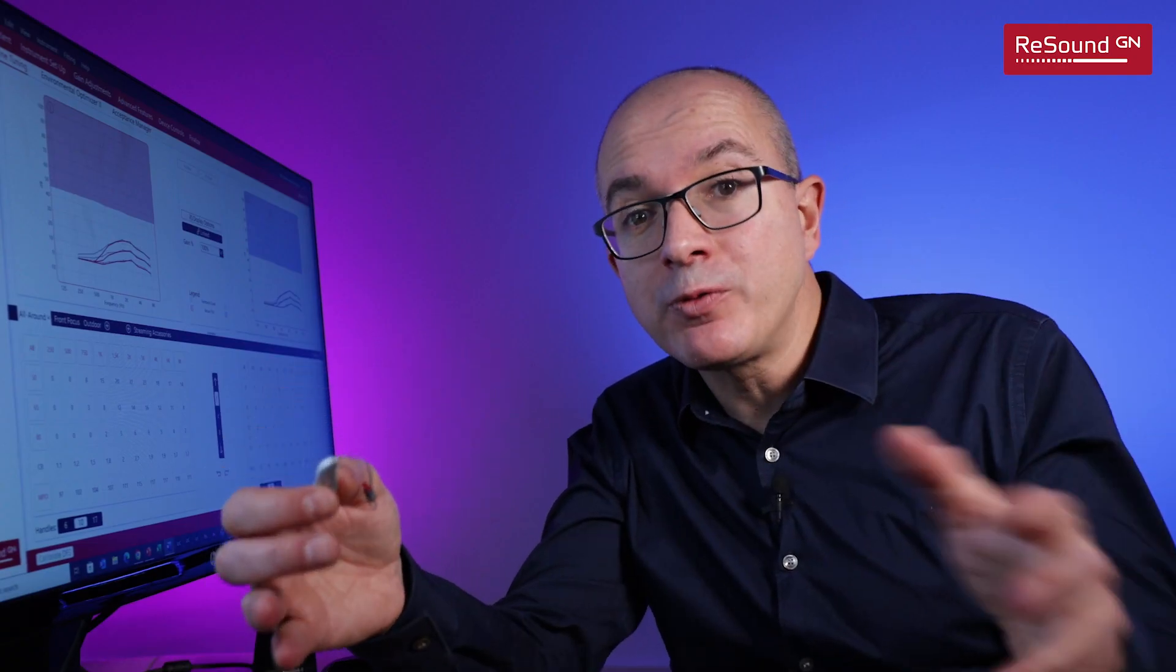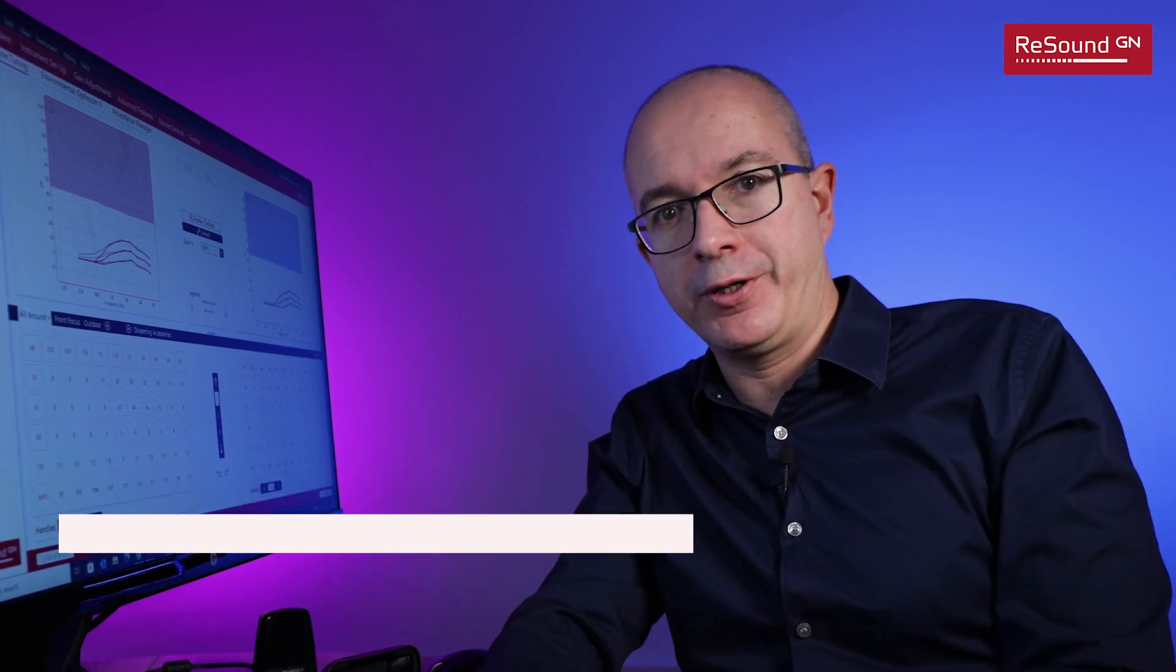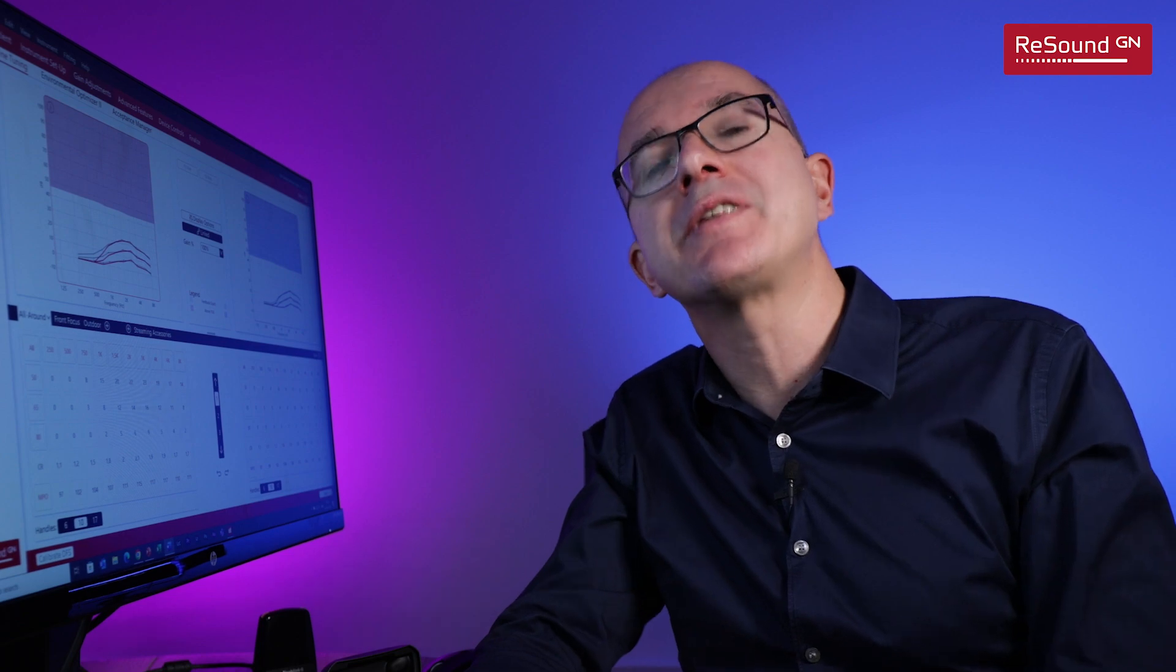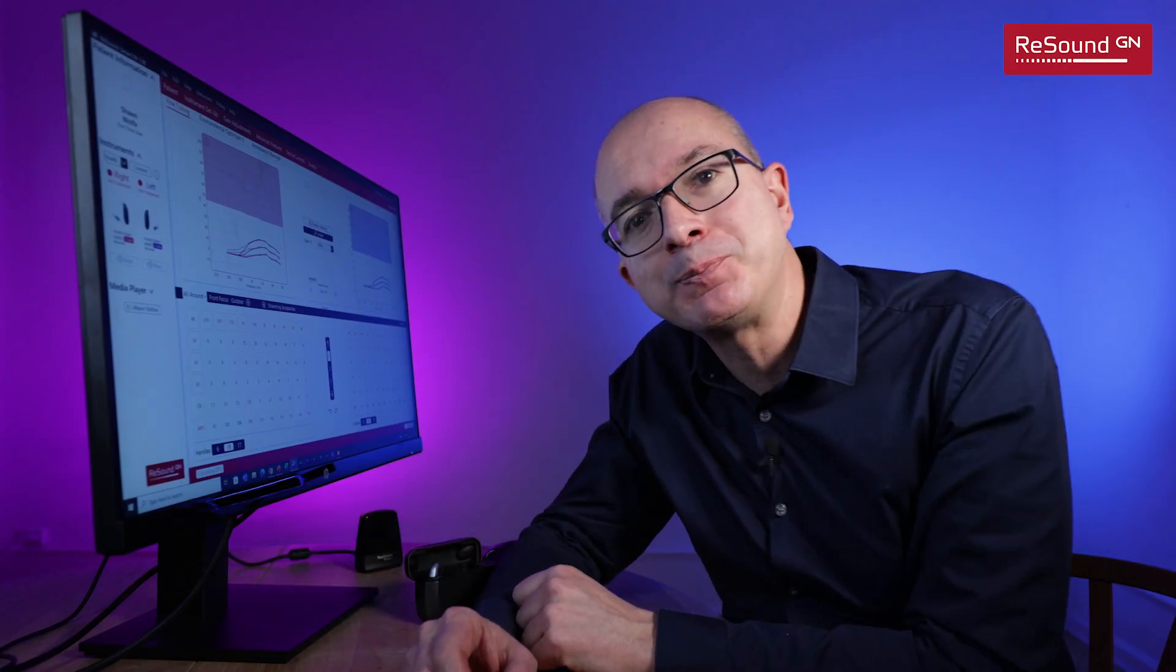If you are new to ReSound, this video will give you the confidence to navigate through the software quickly and without effort so you can start doing great fittings in no time.